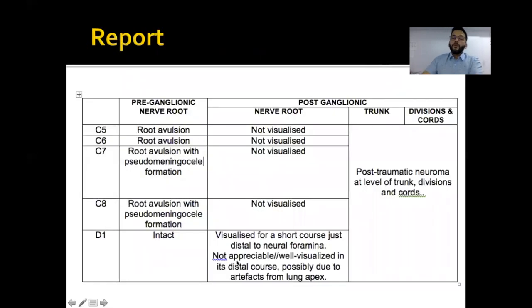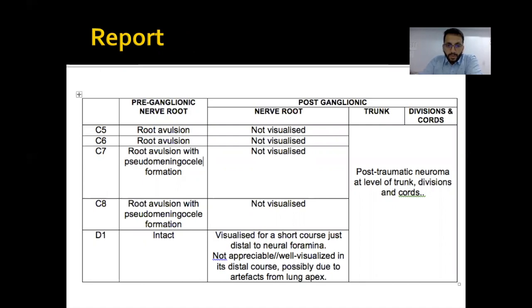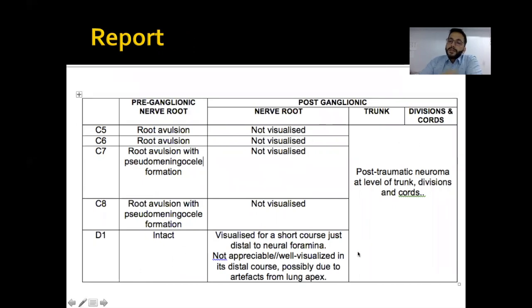This is the reporting format we recommend. It is good to structure the report in two different parts: preganglionic injury and postganglionic injury. In the preganglionic part, we mention nerve avulsions at specific levels; in the postganglionic part, we document changes of neuropraxia, axonotmesis, neurotmesis, or transection.